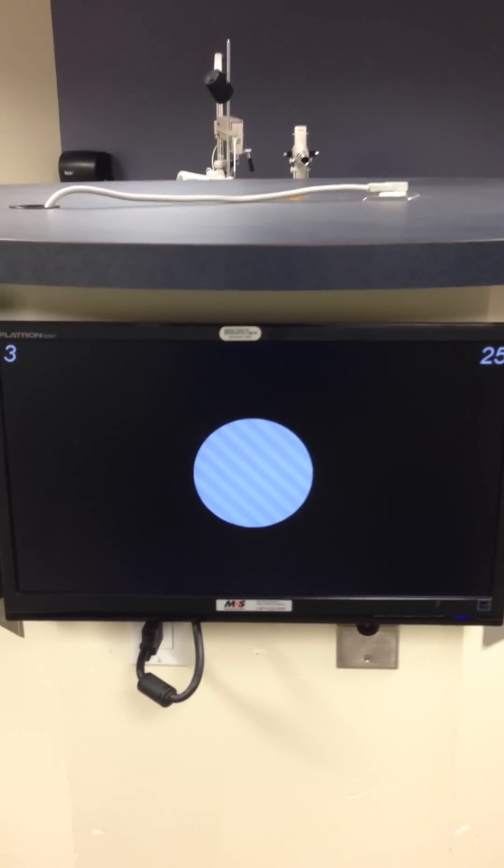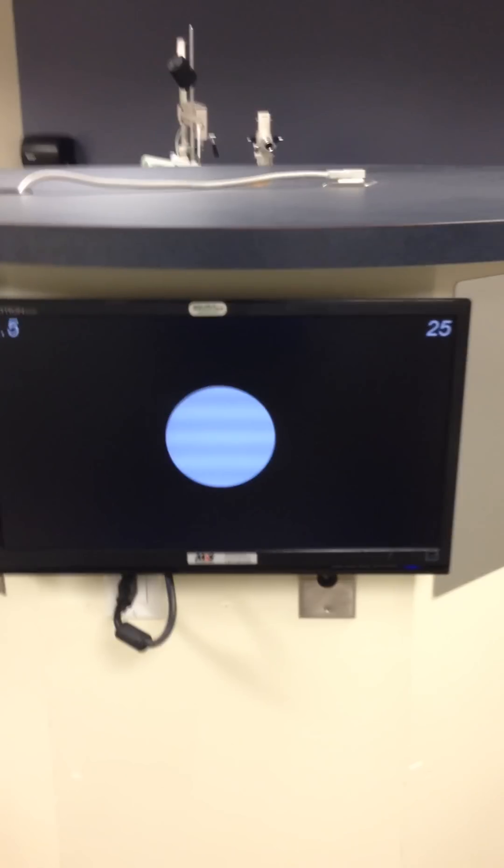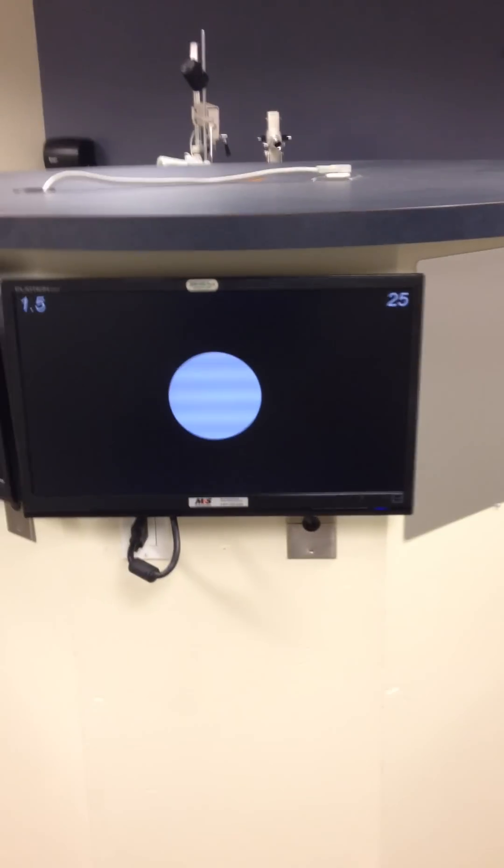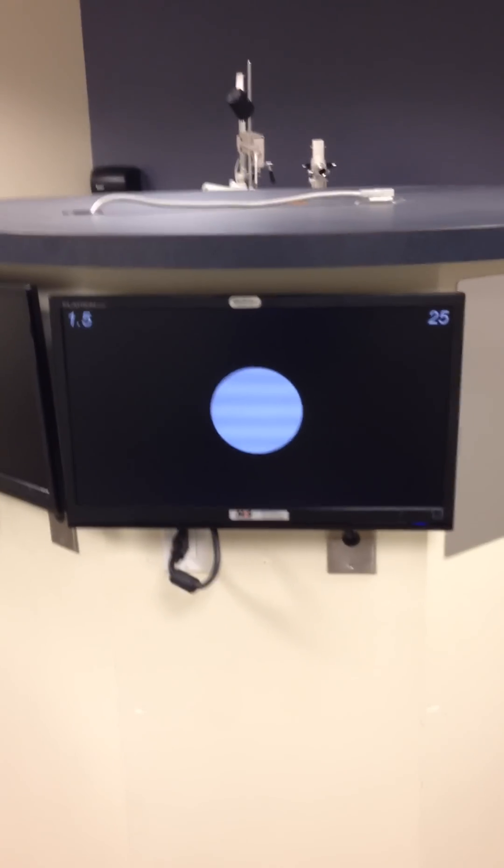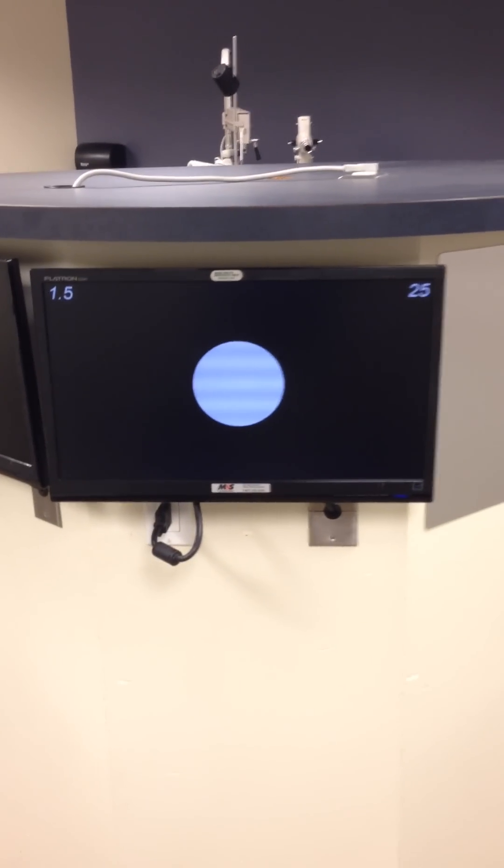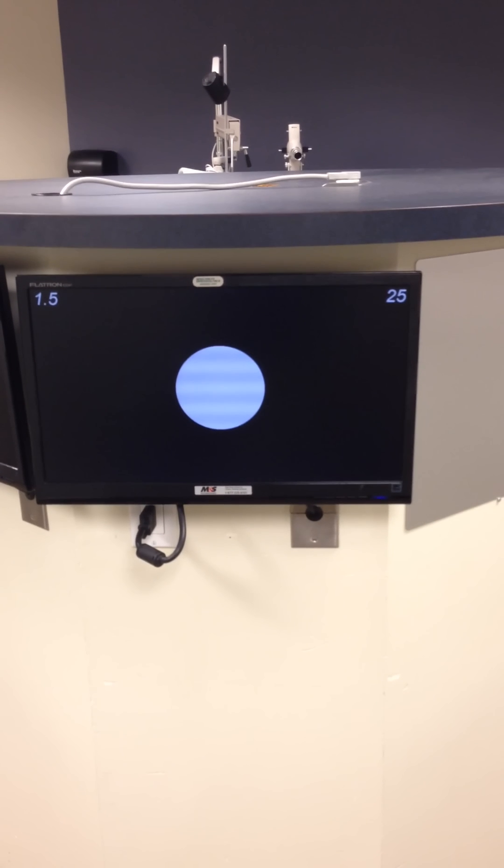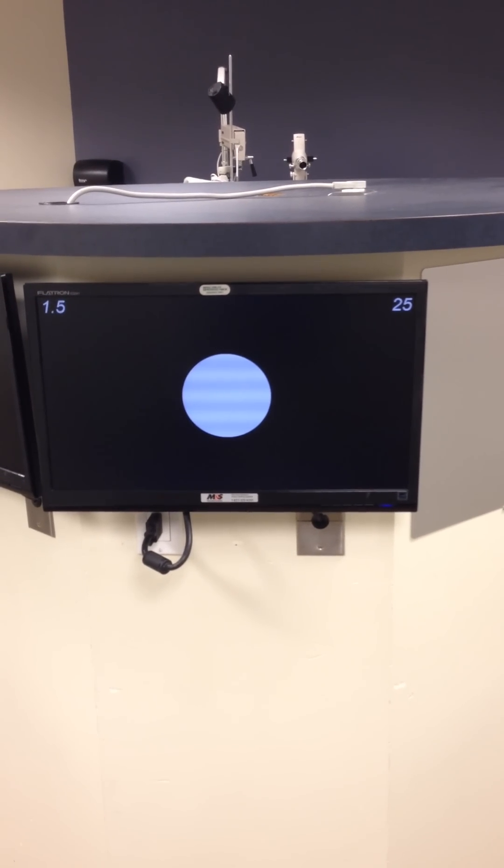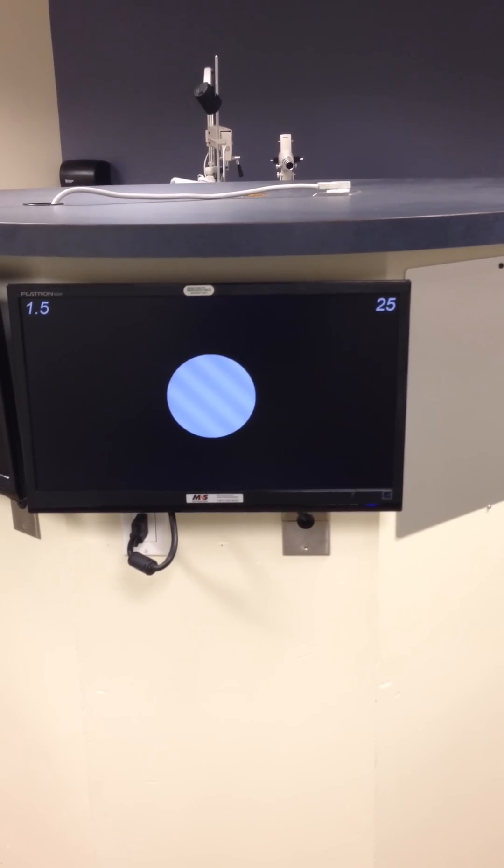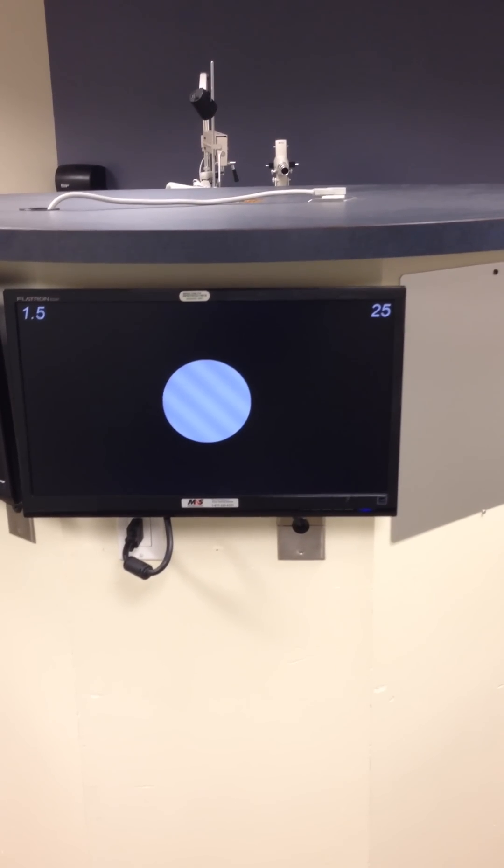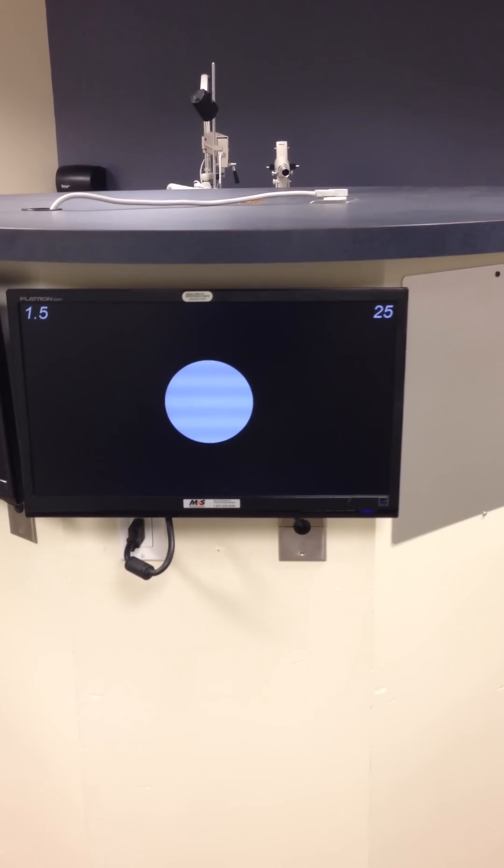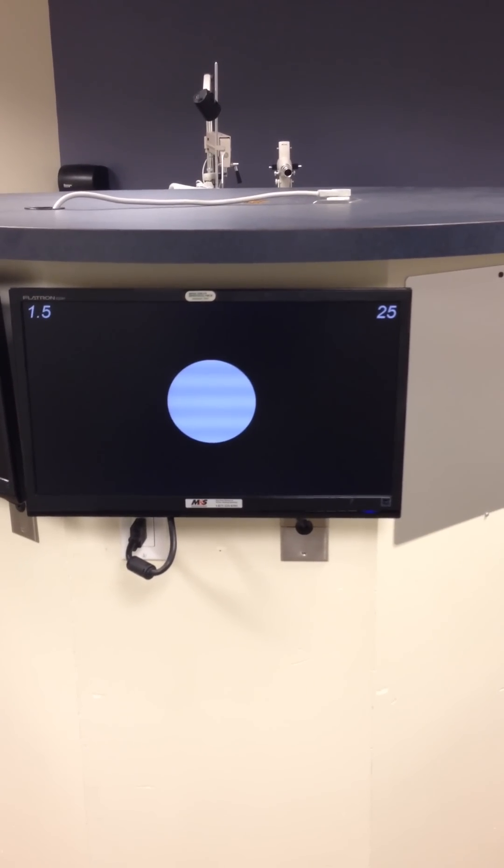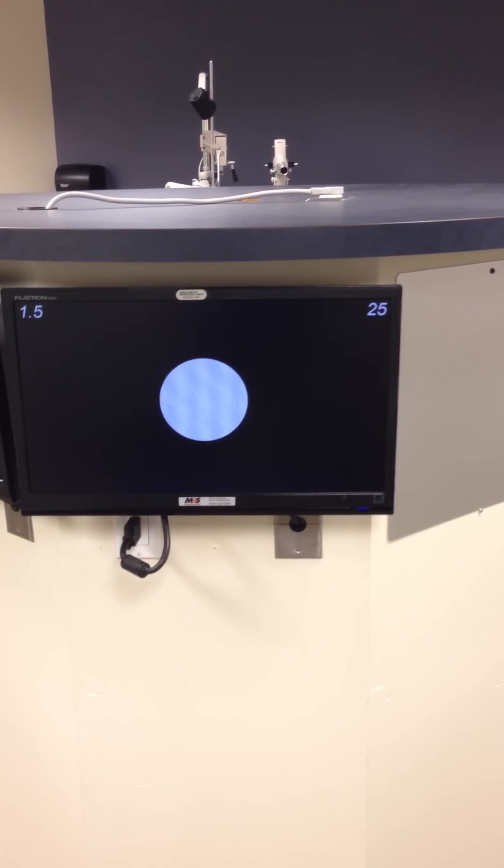If we press the remote, and I'm going to point it at the M&S box and see if it will respond, there we have down to 1.5 cycles per degree. That's bigger than the peak of contrast sensitivity at 20/400. And if we keep pressing the button at that place, it will change the orientation of the stripes.